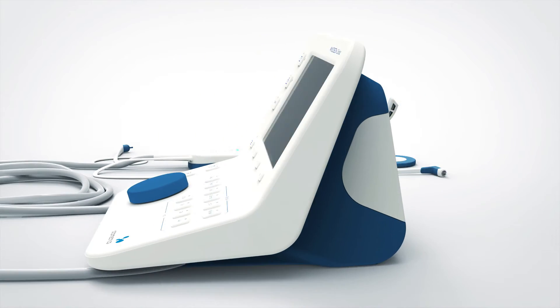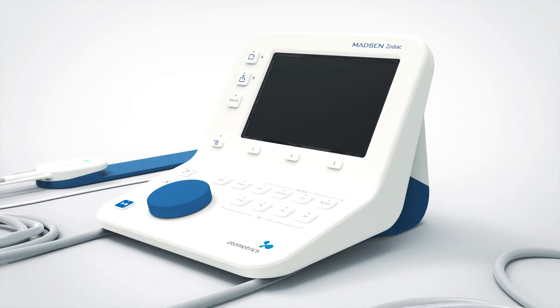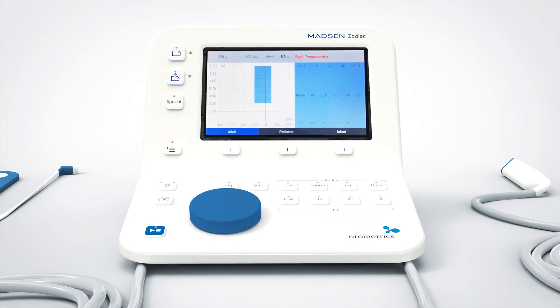To reach the main page, press the on/off button located behind the screen. Here you will see information for tympanogram and reflex screening.